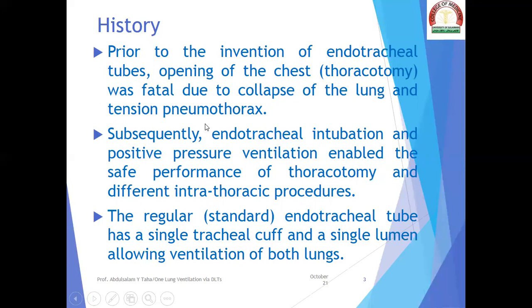Subsequently, endotracheal intubation and positive pressure ventilation enabled the safe performance of thoracotomy and different intrathoracic procedures. The regular or the standard endotracheal tube has a single tracheal cuff and a single lumen, allowing ventilation of both lungs.